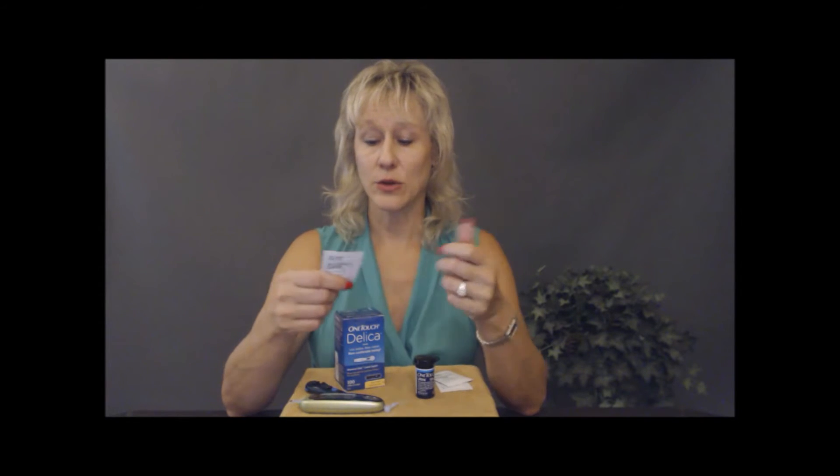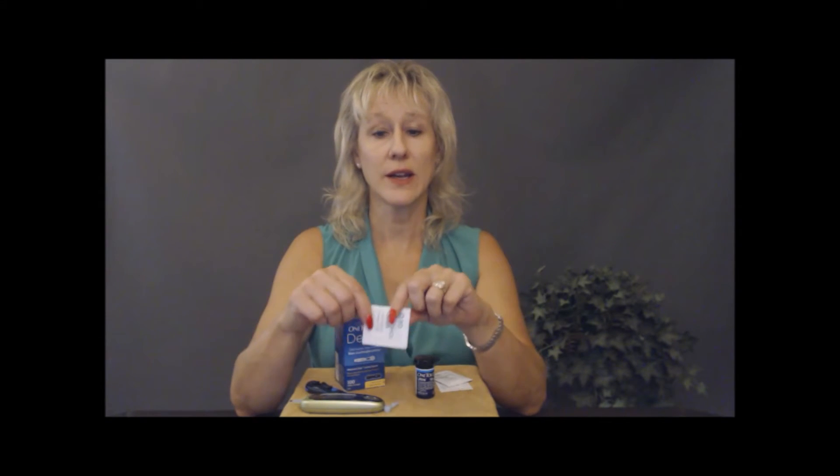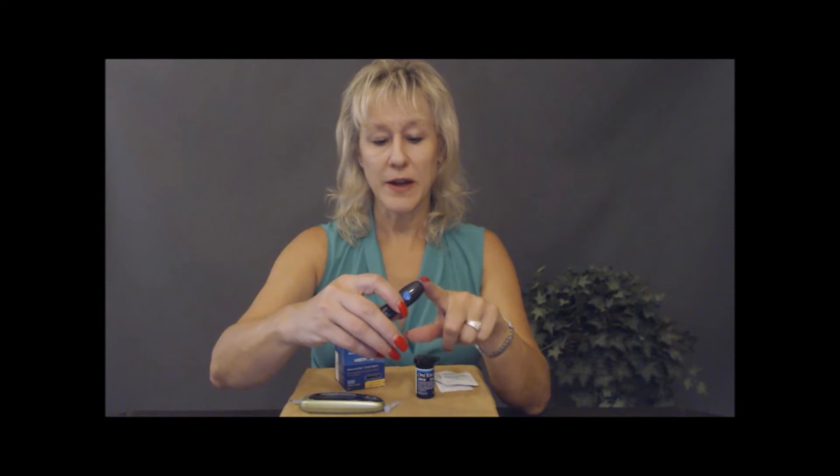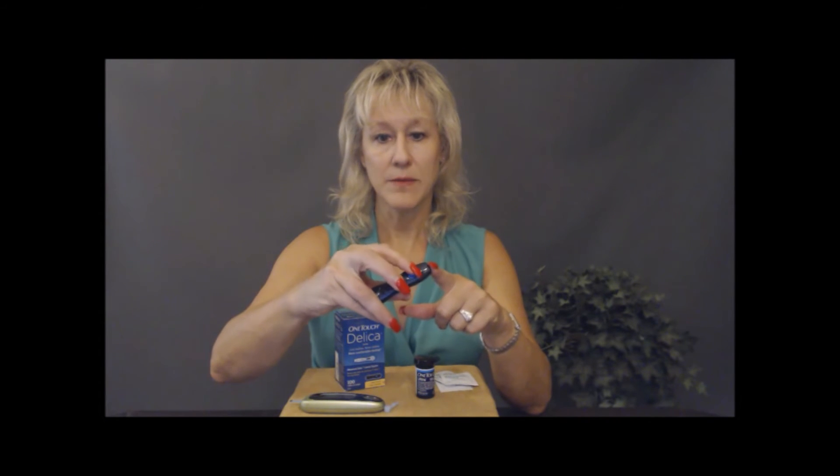Before you do anything, always wash your hands — especially if you've been working with foods that are sweeter, like fruits, because you can get residue on your hands. Always wash with warm soap and water. I also like to use an alcohol pad if I'm traveling. I always keep alcohol pads with me — they're about a buck at Walmart, so they're cheap. Always use that before you find your spot on your finger.